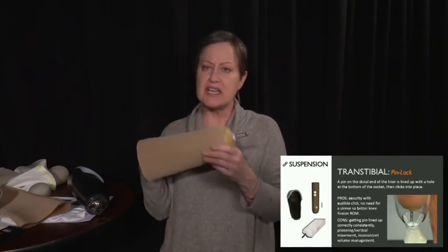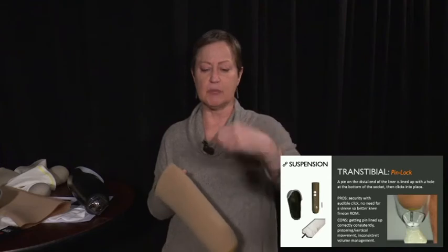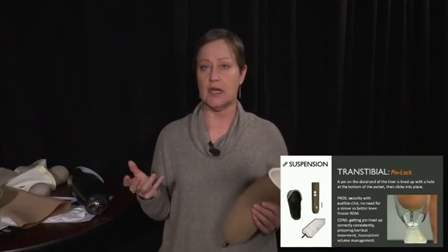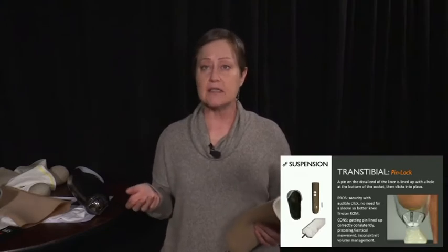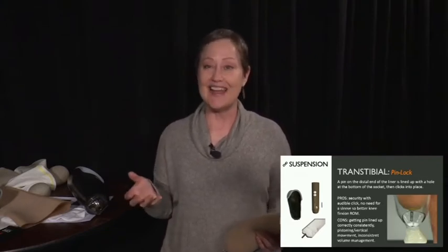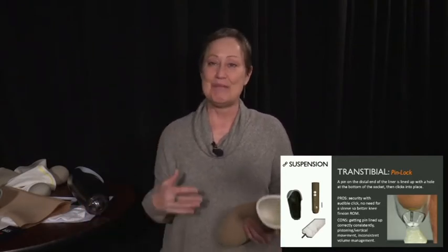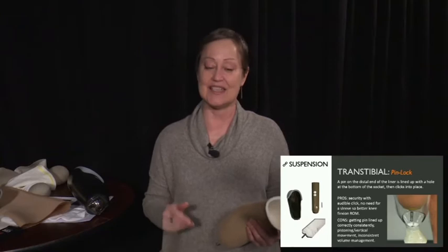I like this picture on this slide because it shows the pin going in. People like this because of the security. I heard the clicks, therefore I know my leg is on. It's like a belt and suspenders. People really want to know that that thing isn't going anywhere.